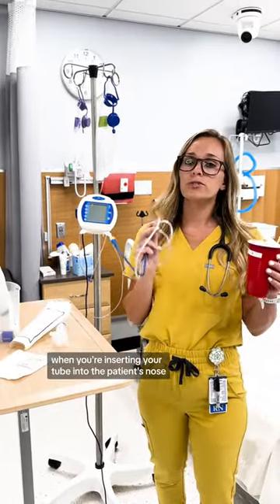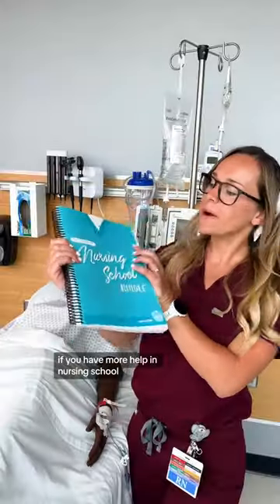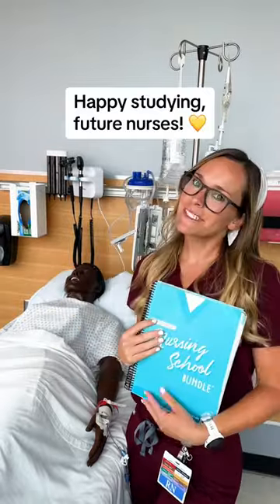When you're inserting the tube into the patient's nose, you want to have them take sips of water as you are inserting it. If you want more help in nursing school, you can find it in the complete nursing school bundle. Happy studying, future nurses.